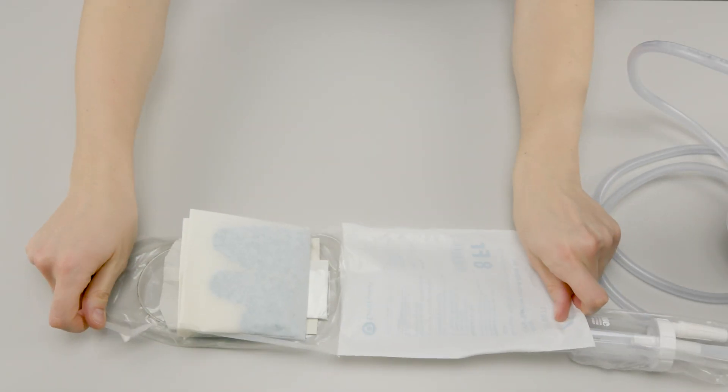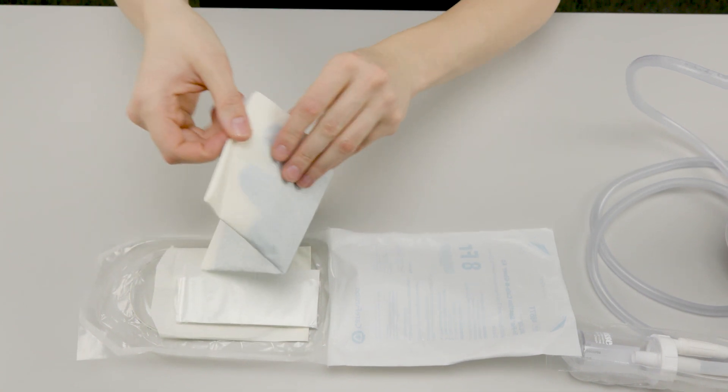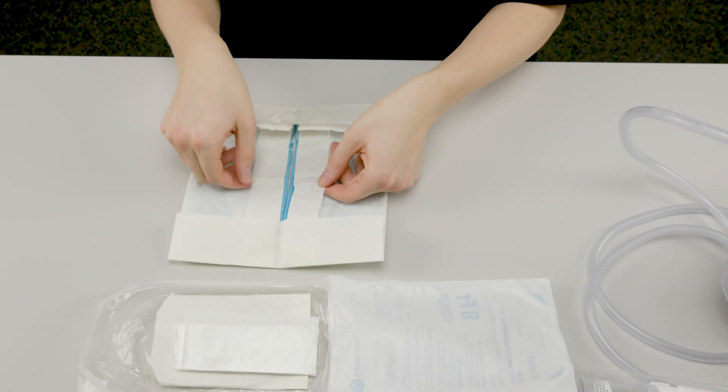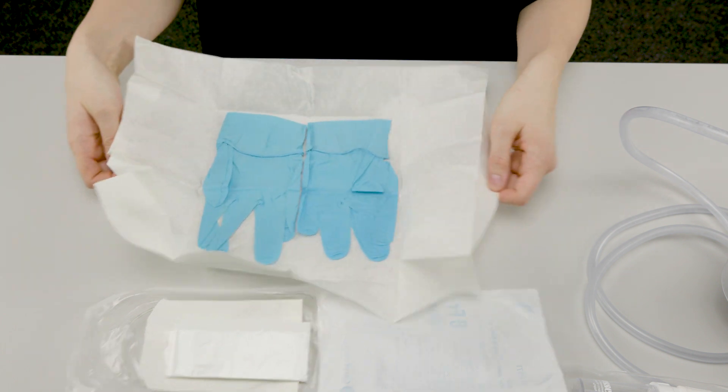When collecting a sample of bronchial secretions from a trach, always use sterile suction technique, even if the patient is normally suctioned using non-sterile technique.